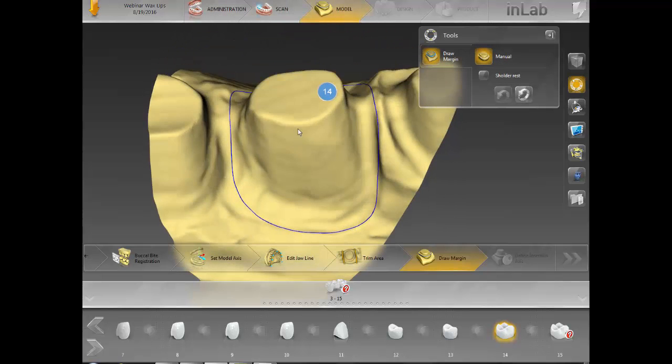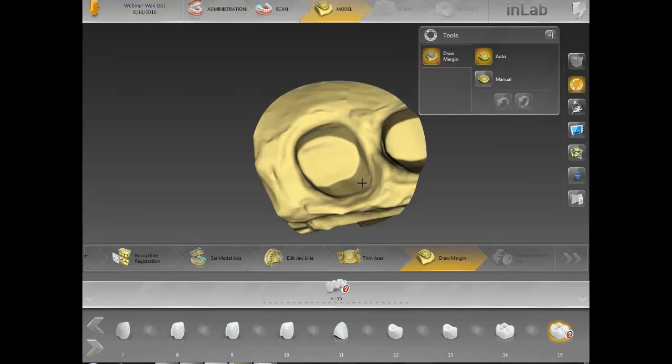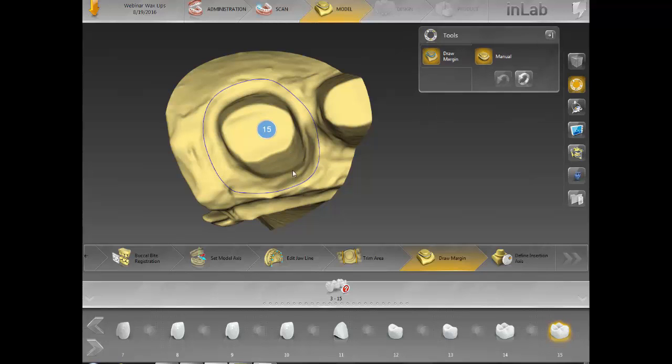You definitely don't want to cross over these lines, especially if you're going to virtually seat these cases — you want to make sure that nothing is crossed. I'm going to show you how to virtually seat in a little bit, and I'll definitely double-check what I did. I want to go on to the next steps, which is getting into the bio jaw section.